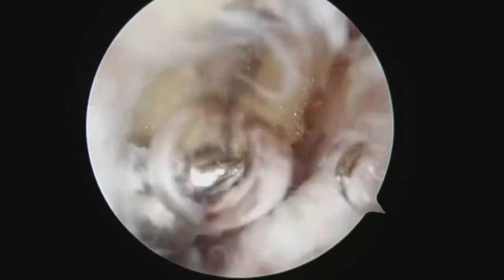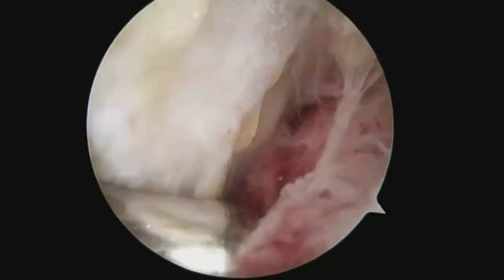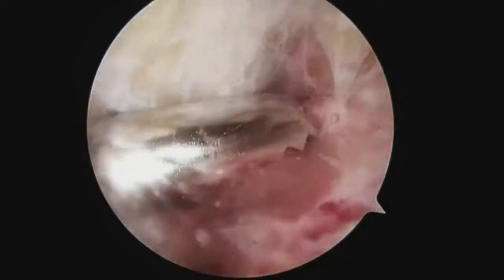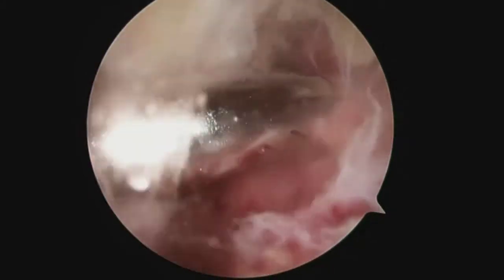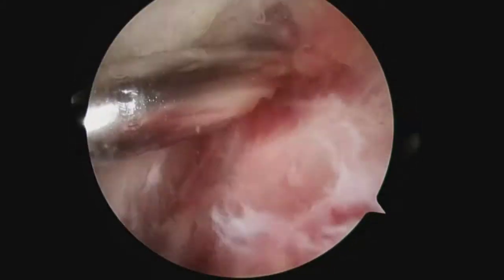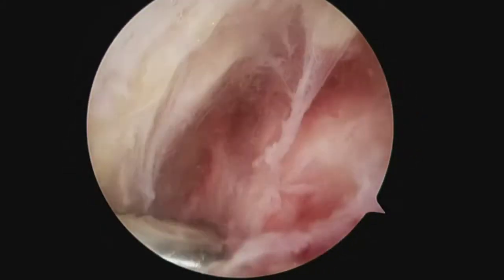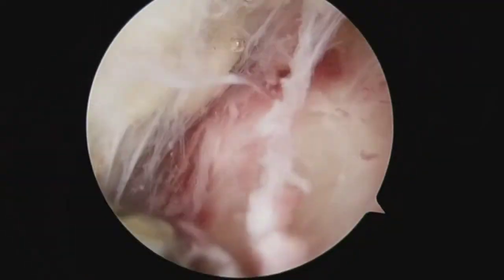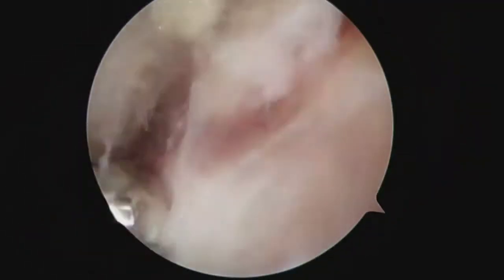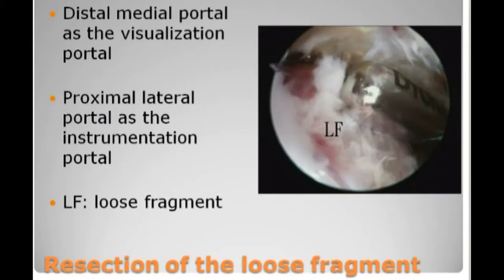The first step is resection of the inflamed bursa over the tibial tuberosity, if present. It is followed by resection of the loose body within the tendon.